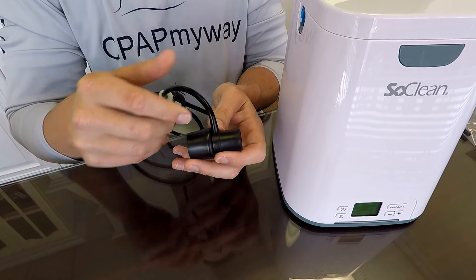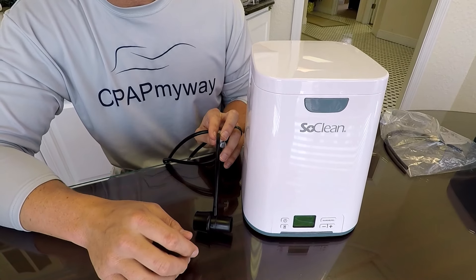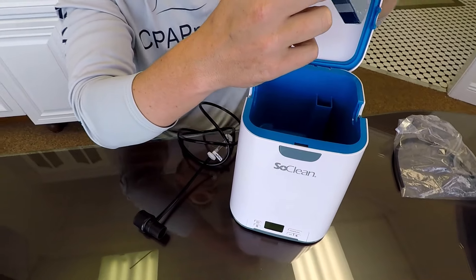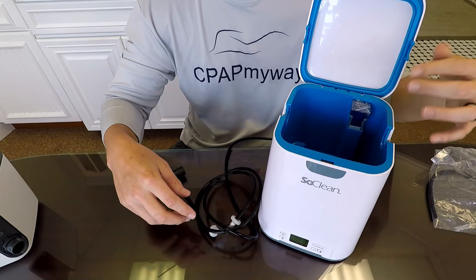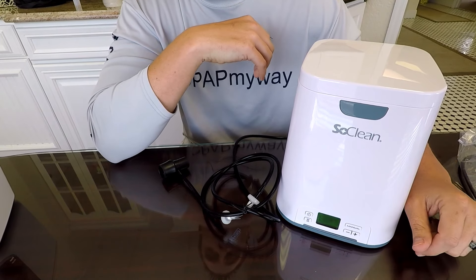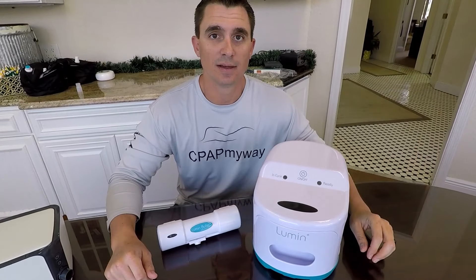It comes with a standard adapter that's good for most CPAP models — it plugs onto the CPAP and your tubing plugs onto the other side. On models with heated tubing, you'll need to get the appropriate adapter separately. You also have a replacement filter and check valve that needs to be replaced every six months. The machine will let you know when it's time, and it's really simple to swap out and reset your device. There is a bumper-to-bumper two-year warranty on this device, and overall we've had a lot of success with it. It's a good, very popular unit.